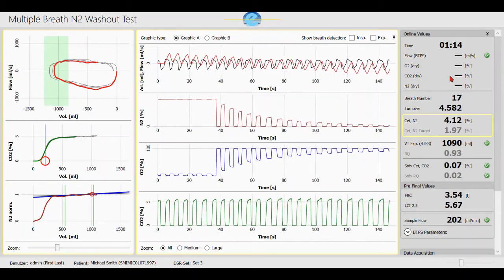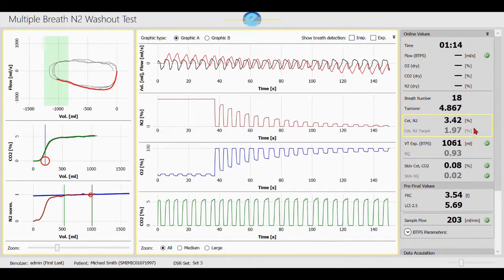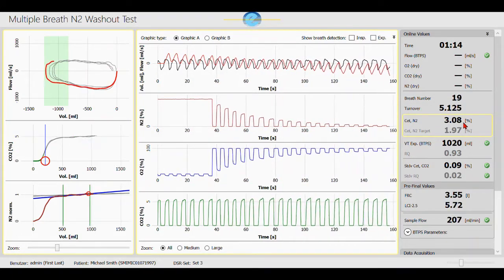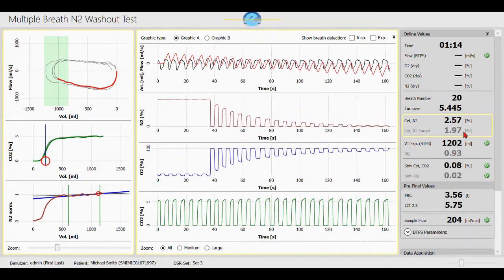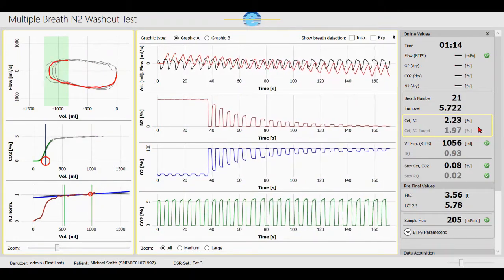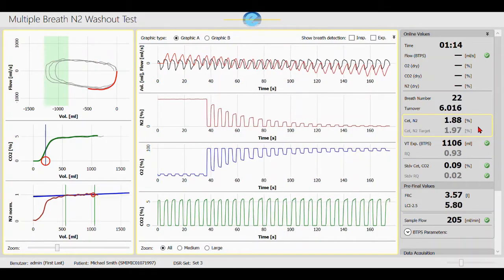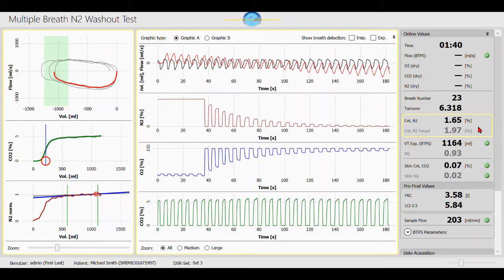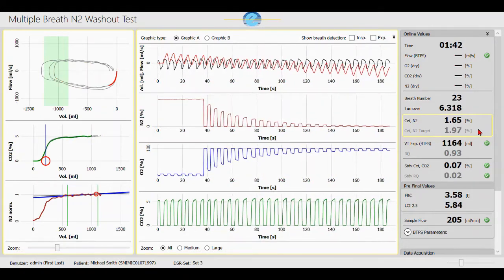On the right side of the screen, we can follow the online values. In the yellow frame, we see the current end tidal nitrogen concentration and the target nitrogen concentration. The exhalizer completes the test automatically as soon as it has recorded three breaths below target, which is typically just below 2% end tidal nitrogen.